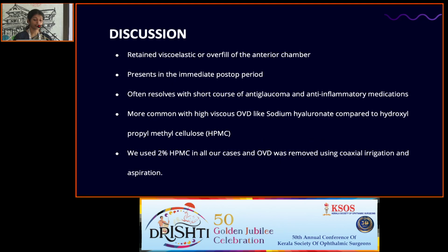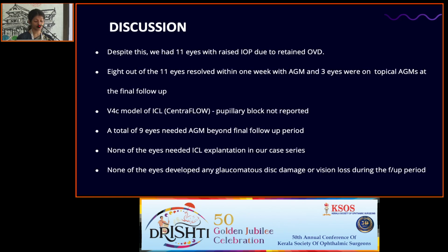The second reason was retained viscoelastic or overfill of the anterior chamber. This presents in the immediate post-operative period, and often resolves with a short course of anti-glaucoma and anti-inflammatory medication. It is more common with high viscous OVD like sodium hyaluronate compared to HPMC. We used 2% HPMC in all our cases and OVD was removed using coaxial irrigation and aspiration. Despite this, we had 11 eyes with raised IOP due to retained OVD.